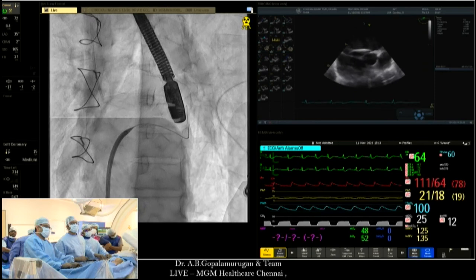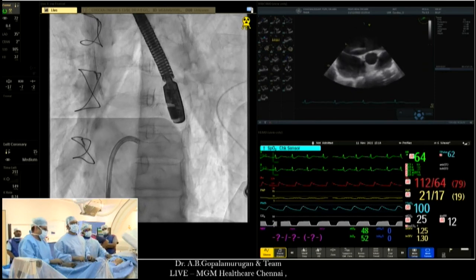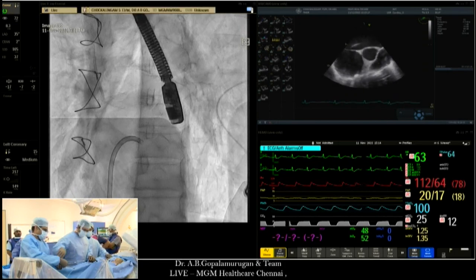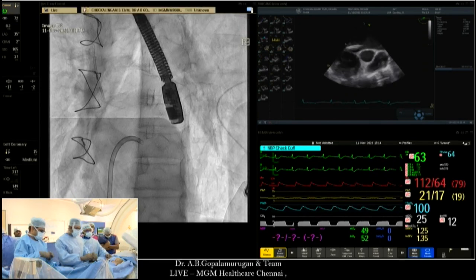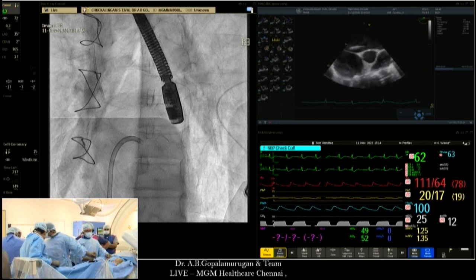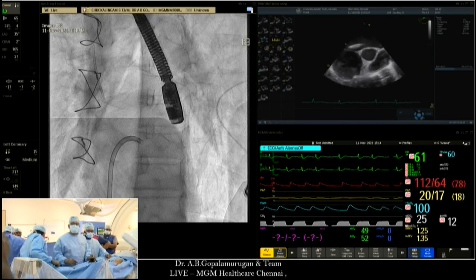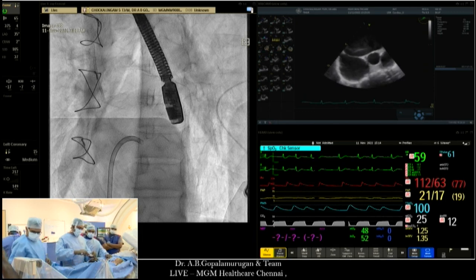Yeah, this is very important for valve-in-valve procedures. Usually, you should know the previous valve sizes, and there is a beautiful app by Dr. Vinayak Bapat for valve-in-valve aortic and valve-in-valve mitral. You just have to go into that app. If you know your valve, you can get a true ID to valve size, and you can easily select your valve from that app.